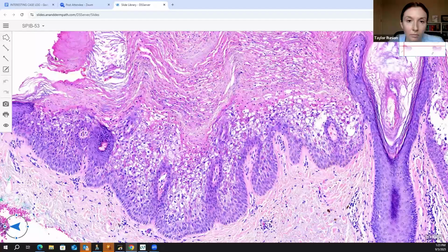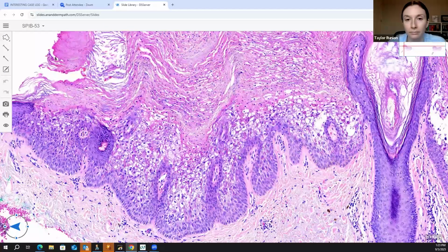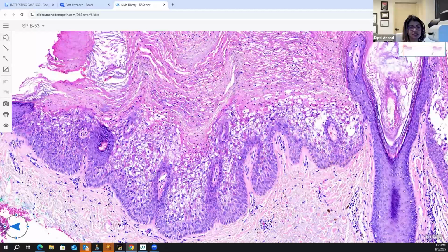The two things in the nutritional deficiencies: first of all, the granular cell layer is not there. It's confluent pallor or cavitation on the top, and it's a psoriasiform process. And most importantly, the process there is necrolysis. So I wouldn't even use the term ballooning degeneration, though I know that all of you love to use it. To me, ballooning degeneration is what I showed you in orf, that classic slide. It's not really ballooning degeneration there, but I understand because everybody uses that, so I'm not going to say no to it. But it is actually necrolysis of the top layer, so the bottom is spared.